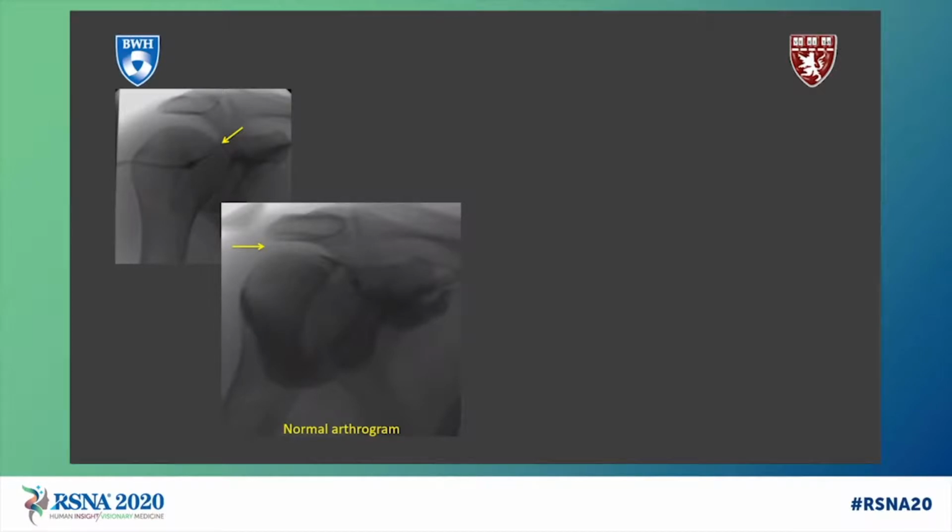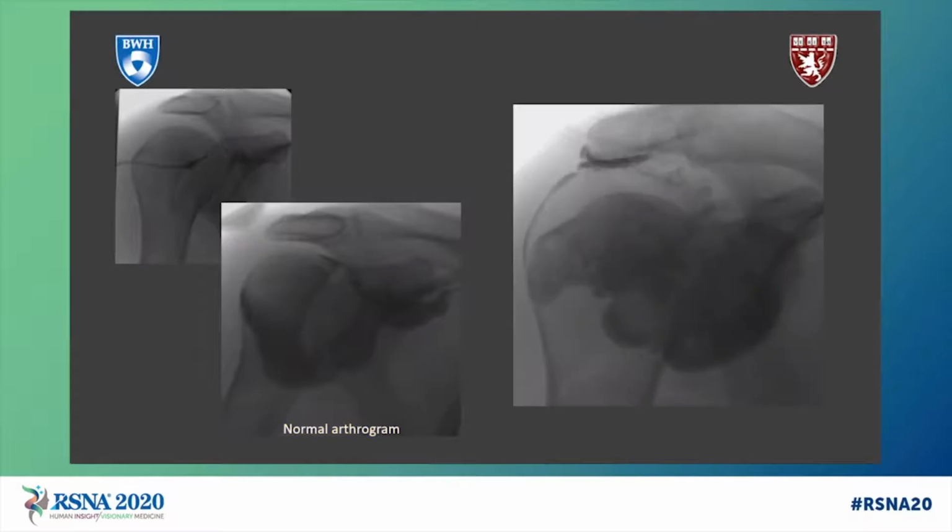again, in the initial injection of contrast, we should see the glenohumeral crescent outlining the intra-articular nature of the contrast, and normally the absence of subacromial subdeltoid bursal fluid, indicating that all of the contrast is confined within the glenohumeral joint. And in the case that we're looking at here, we recognize that we see contrast within the subacromial subdeltoid bursa.